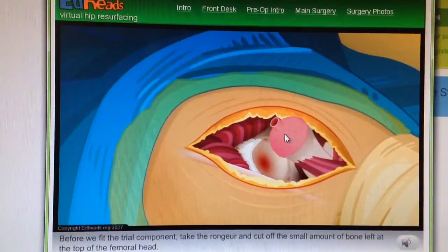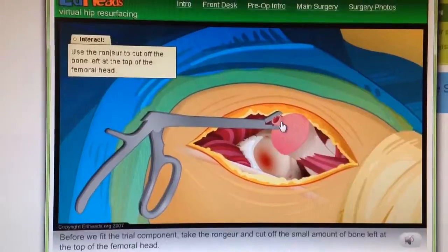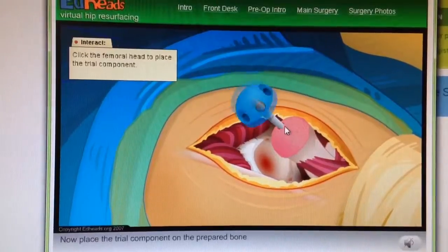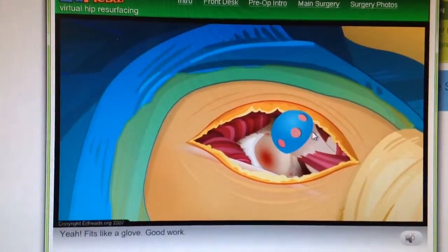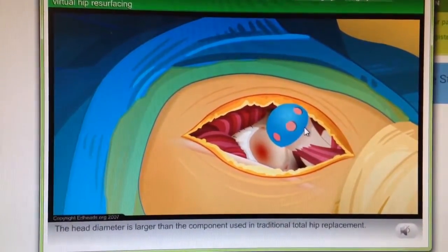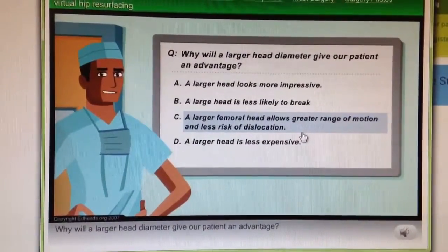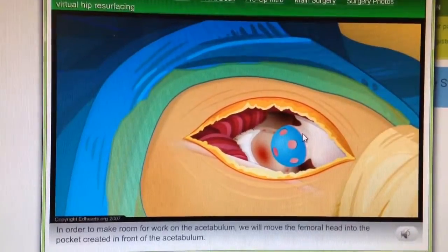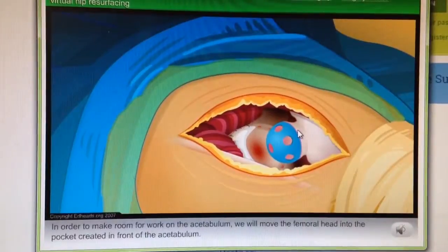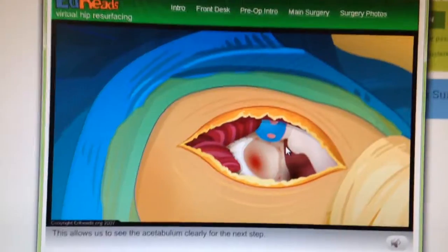Before we fit the trial component, take the rongeur and cut off the small amount of bone left at the top of the femoral head. Now place the trial component on the prepared bone — fits like a glove. Good work. The head diameter is larger than the component used in traditional total hip replacement. Why will a larger head diameter give our patient an advantage? That's correct. In order to make room for work on the acetabulum, we will move the femoral head into the pocket created in front of the acetabulum. This allows us to see the acetabulum clearly for the next step.